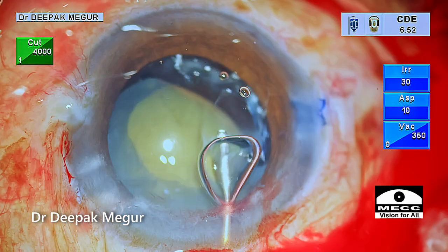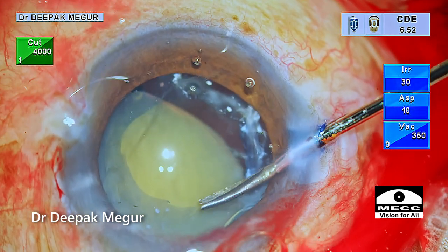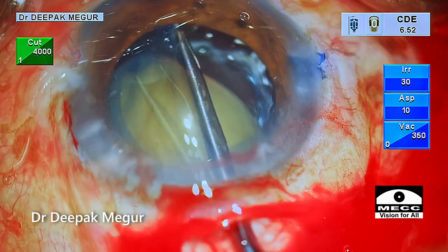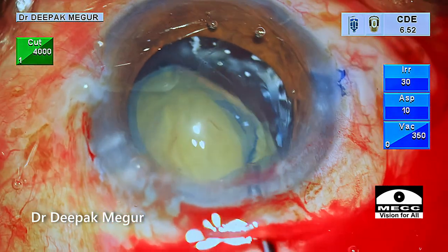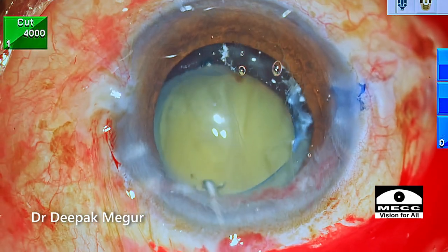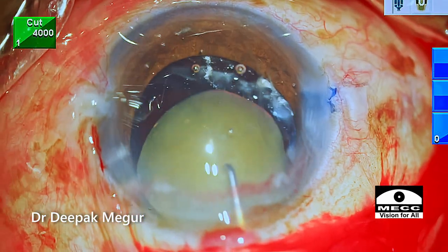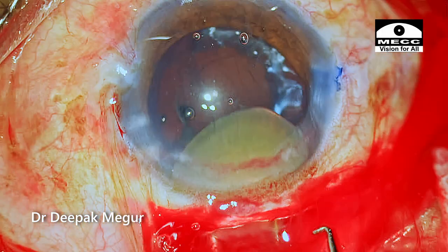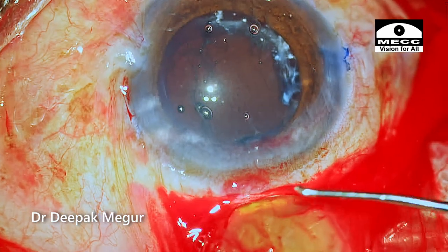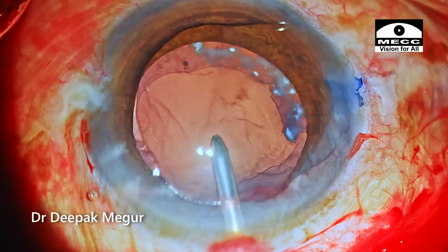Once the problematic area with the weak zonules is taken care of, the rest of the capsule is dealt with in a conventional fashion using scissors and forceps. Once we have a decent-sized opening in the capsule, the nucleus is gently maneuvered out of the bag and removed out of the eye. Gentle irrigation is then done to flush out any remaining cortex.